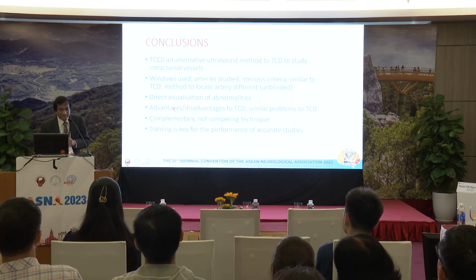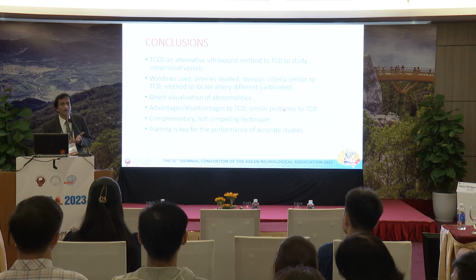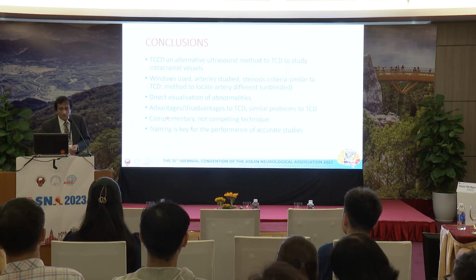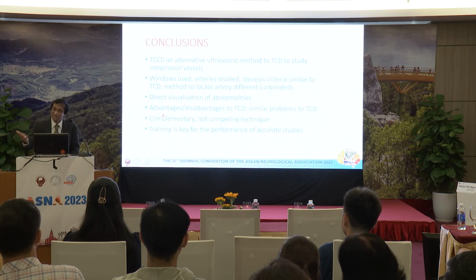There are many pluses, maybe some minuses compared to TCD. Some are similar problems, like no window. Both TCD and TCCD have similar problems. So don't think they're fighting. They help each other. No TCD, use TCCD. No TCCD, use TCD. But TCD has very special benefits.